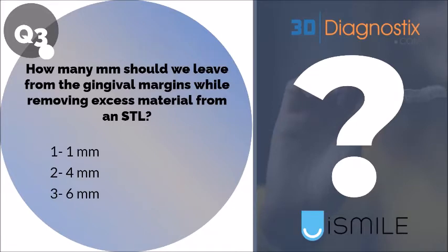Okay, we have 11% saying 1 millimeter, we have 78% saying 4 millimeters, and 11% saying 6 millimeters. Actually, the correct answer is 4 millimeters.